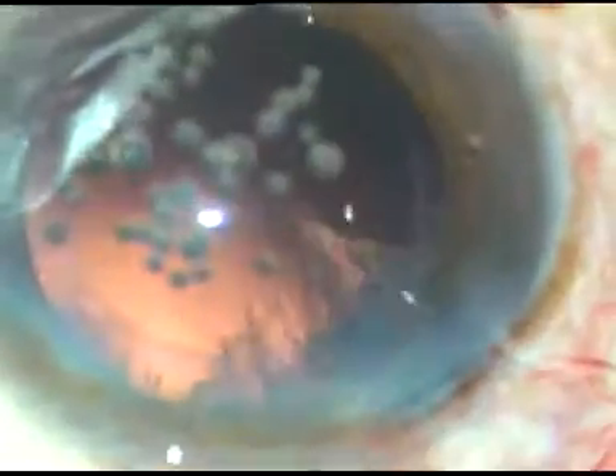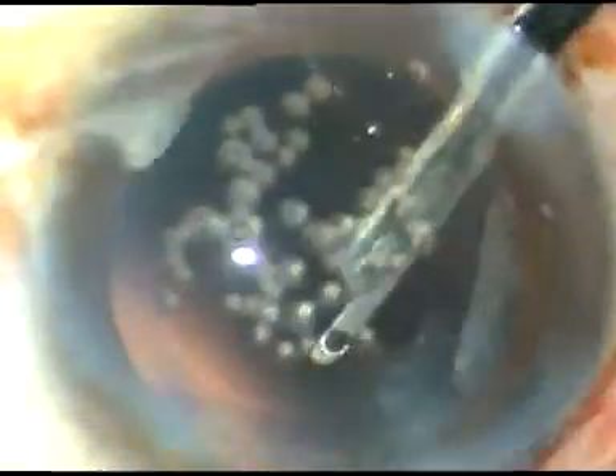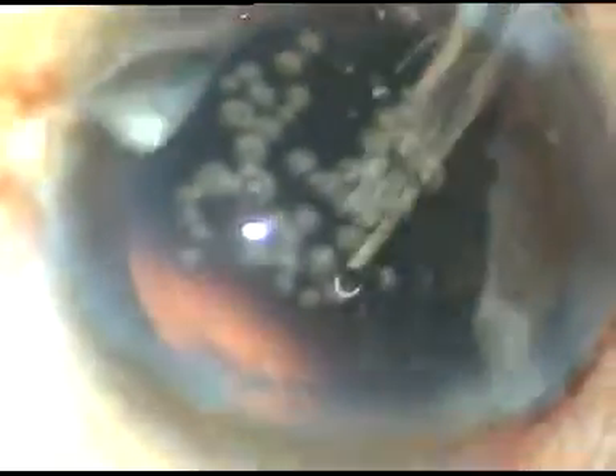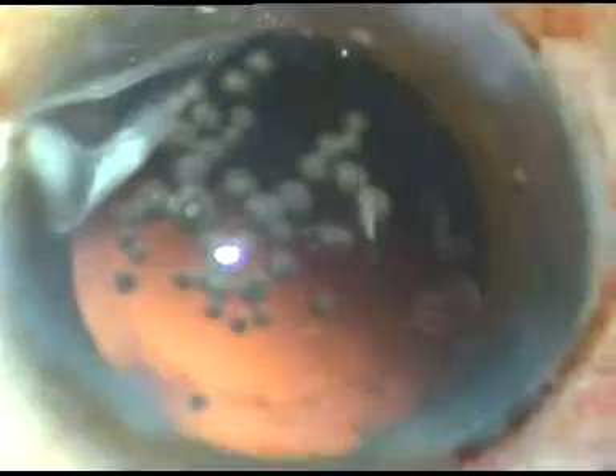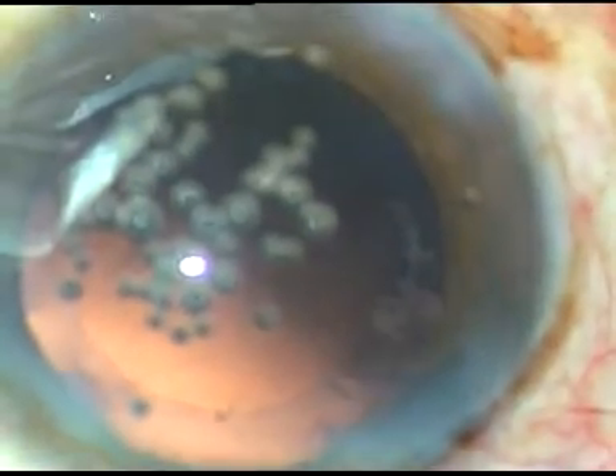You can use bimanual irrigation-aspiration if you want. The cortical matter is removed. See the small air bubbles sticking to the corneal endothelium — they hardly move, which indicates that the endothelium is nicely protected.